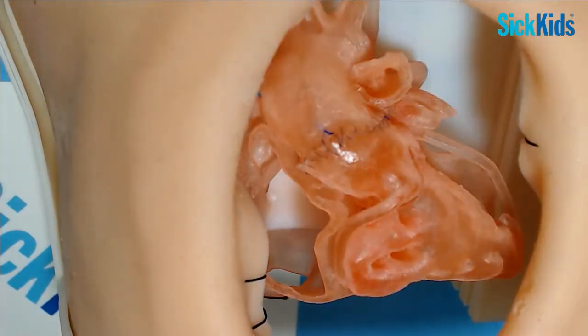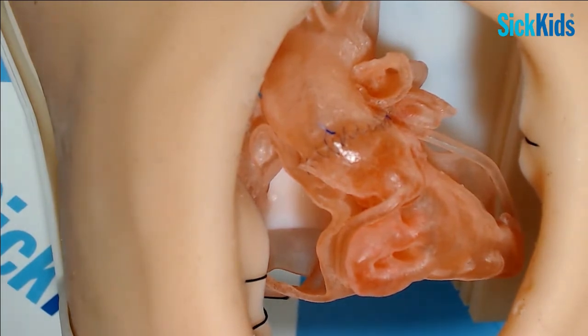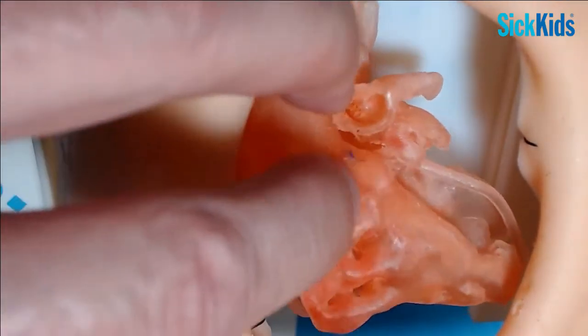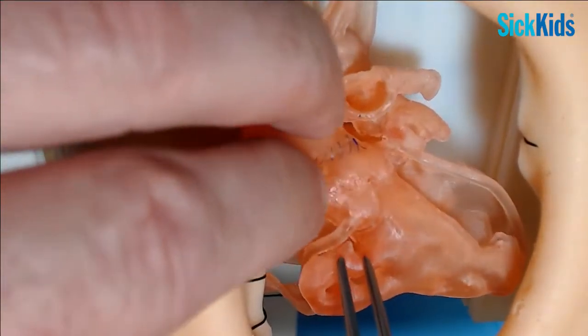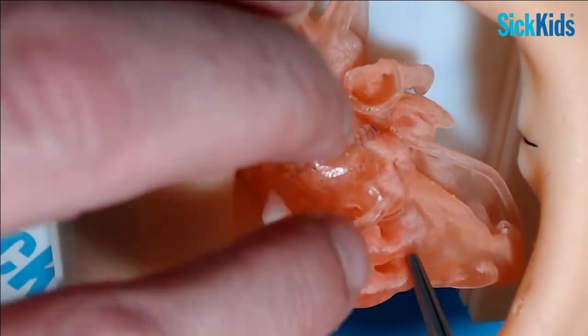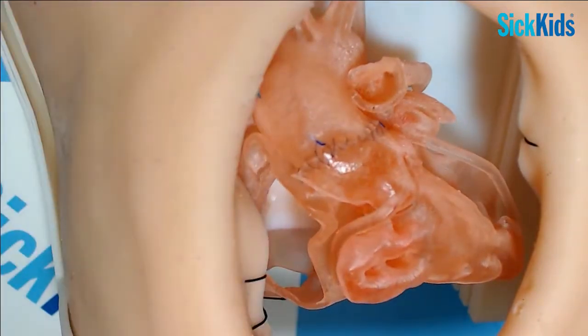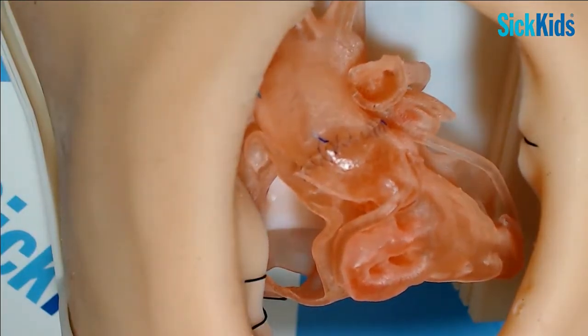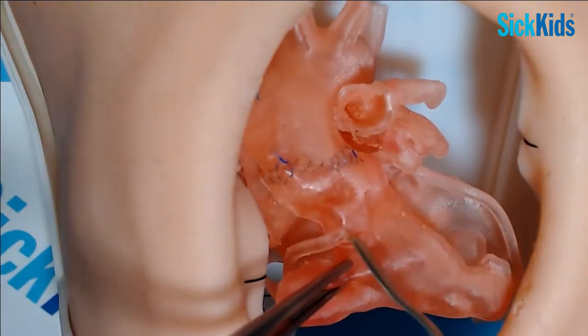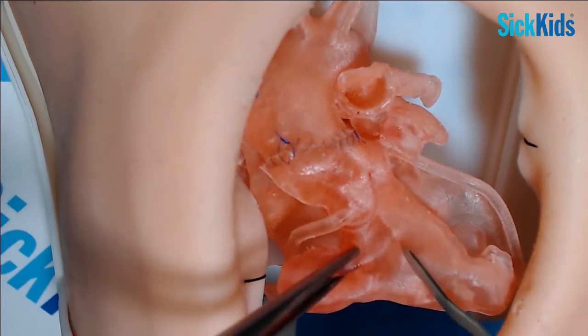The next thing to do is make your ventriculotomy, and as I say, this model is a bit too kind to you, because you can see the truncal root very clearly on the model because of the way that the MRI has been reconstructed. But often you can't really see the cusps as nicely as that, and you have to remember the trunk comes quite deep inside the heart, and that you absolutely don't want to risk damaging the truncal valve by making your ventriculotomy too high.